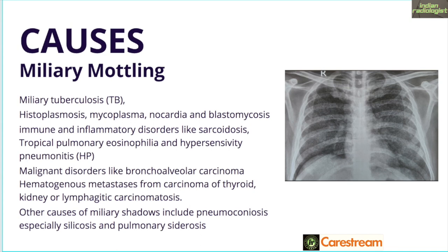In the elderly, you are looking at malignant disorders like bronchoalveolar carcinoma and hematogenous metastasis from carcinoma of the thyroid, kidney, or even lymphangitic carcinomatosis. Some other causes of miliary shadows can include pneumoconiosis — although those nodules will be slightly larger — and silicosis and pulmonary siderosis. Now we have to understand the difference between miliary mottling, pulmonary micronodules, and pulmonary masses.